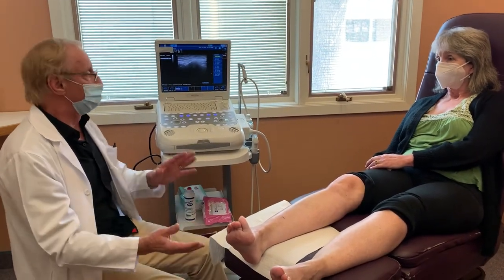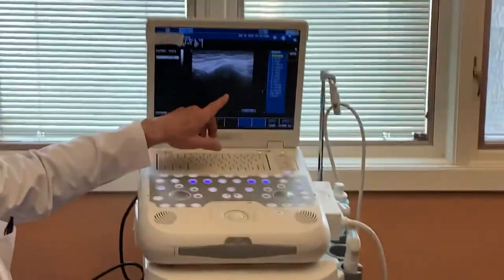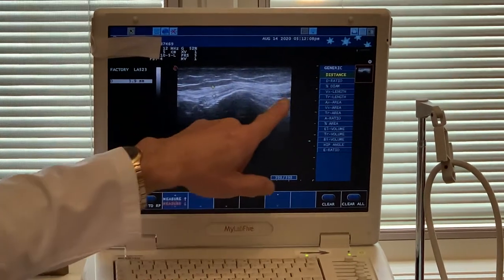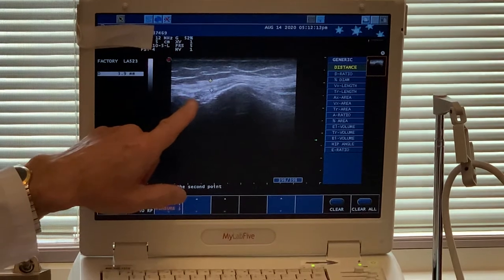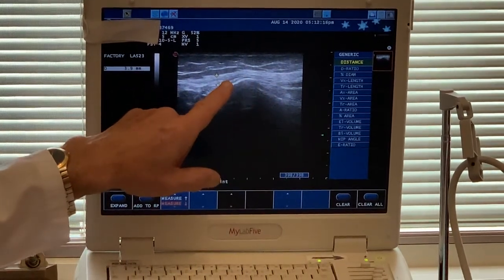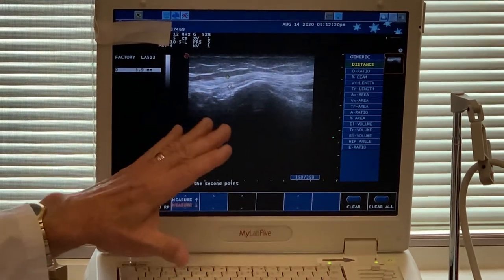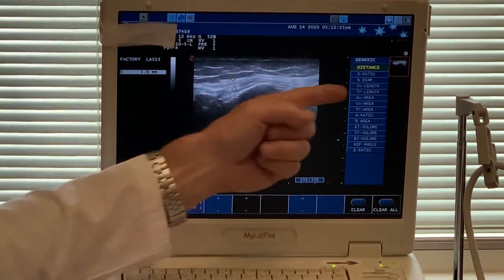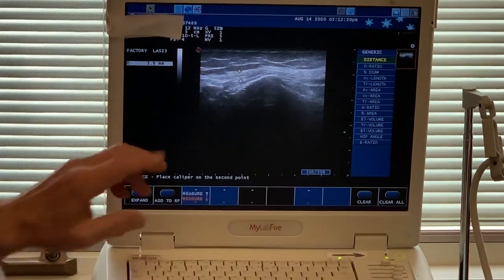I want you to come over here and look at this because we're going to zoom in a little bit. This is called the common peroneal nerve, and this is actually looking at it along the length of the nerve. As I'm pointing to it going down, this would be going down towards the foot — we've already done some measurements. Going in the other direction would be going up towards her hip, and going down in this direction would be going down towards the foot.